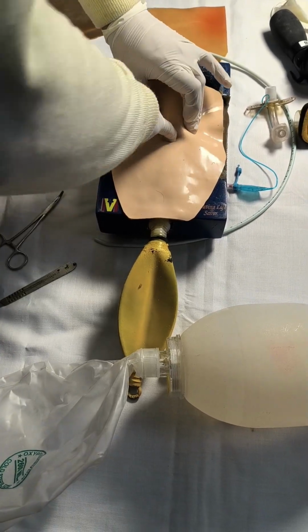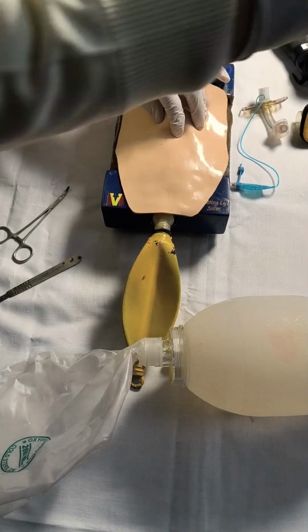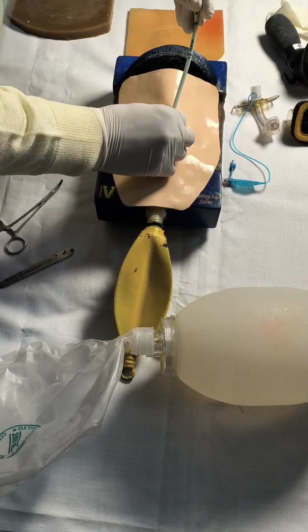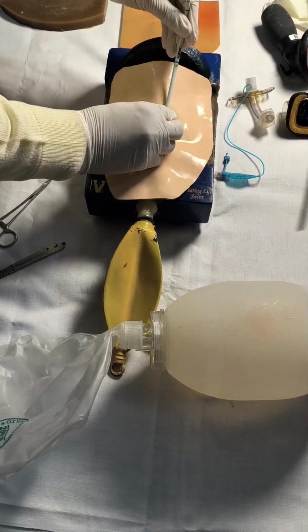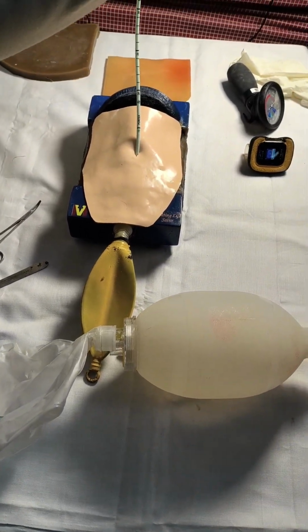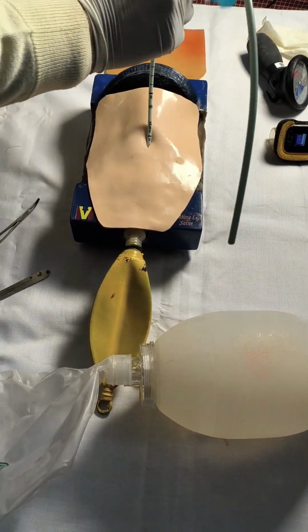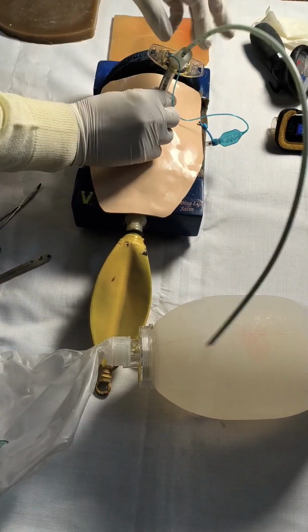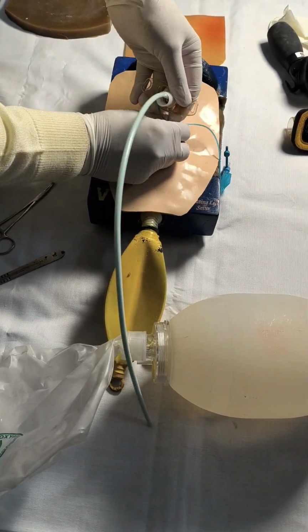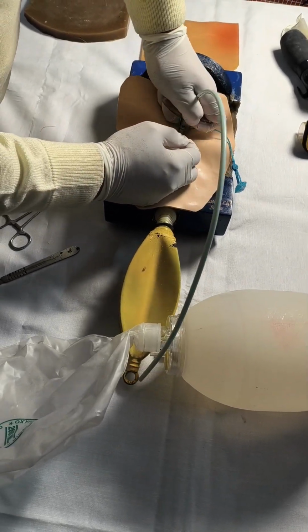And then you dilate with your finger, and then you pass the bougie. Because I am doing deliberate practices, I am not using any assistant. And then I'm passing the tube. I'm doing deliberate practice because in high stake procedure, you never know when the patient can come. So it is better that you do deliberate practices and master the procedure.